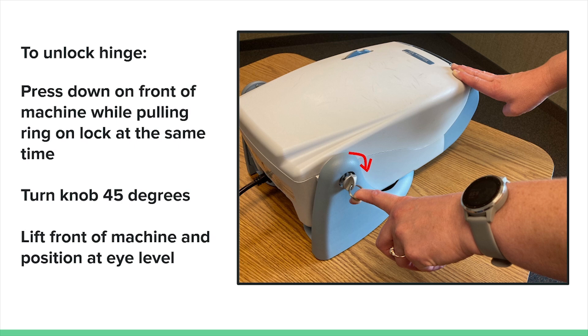When you remove it from the case, the machine will be locked in a flat position. To unlock the hinge, use one hand to push down gently on the front of the machine, and at the same time, pull gently on the ring on the side of the machine and twist 45 degrees. The hinge will unlock, and you can freely position the machine up and down as needed.